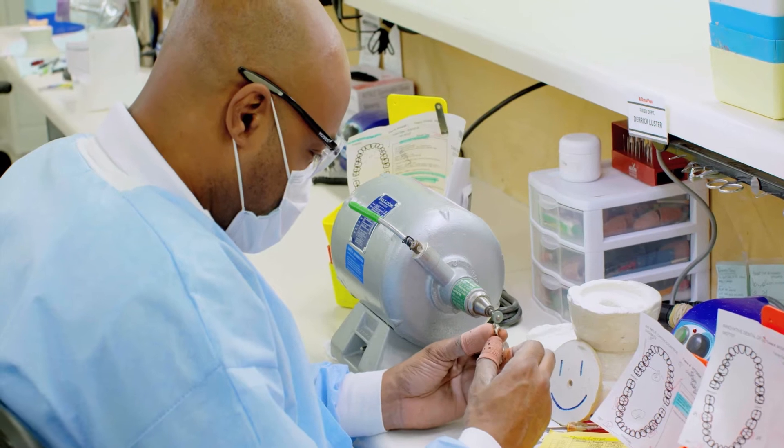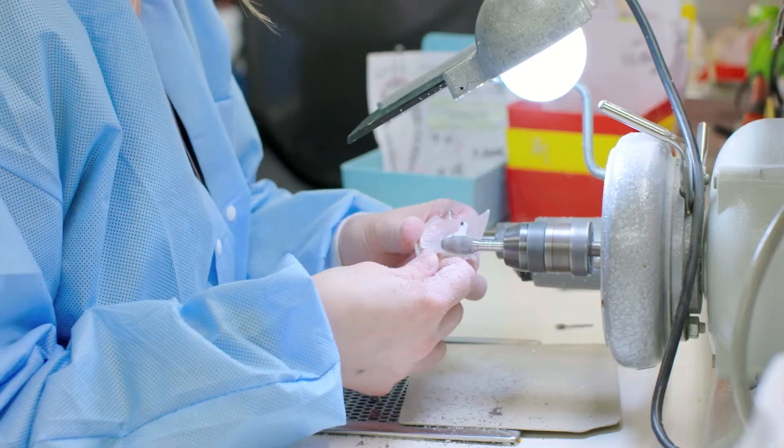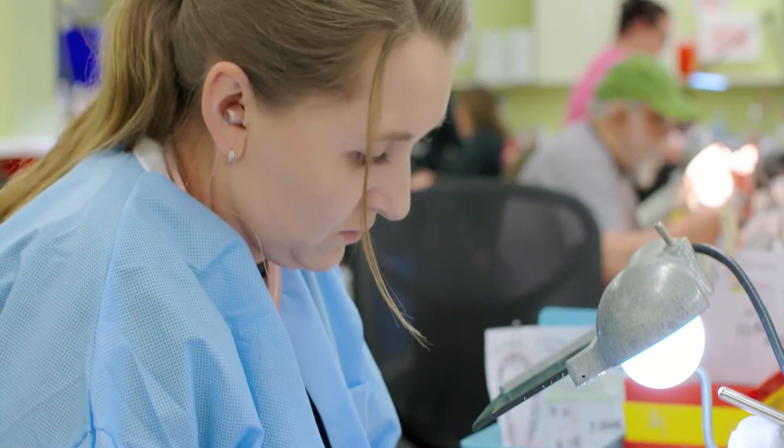We knew with the development of the easy align clear aligners that we were going to have to get a printer that could keep up with the speed and also provide the efficiency and the high quality that we require for our manufacturing.